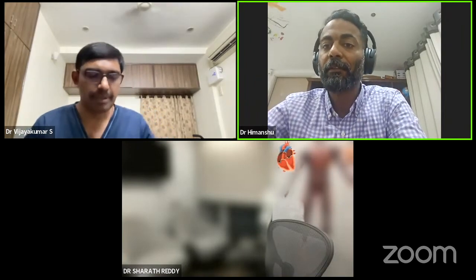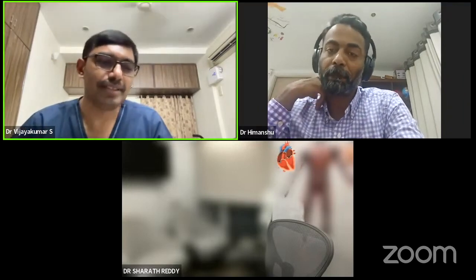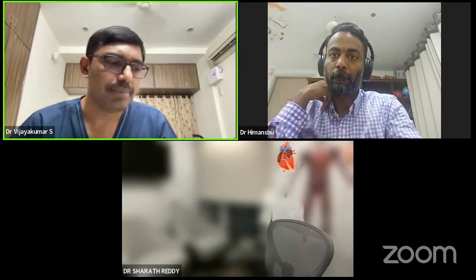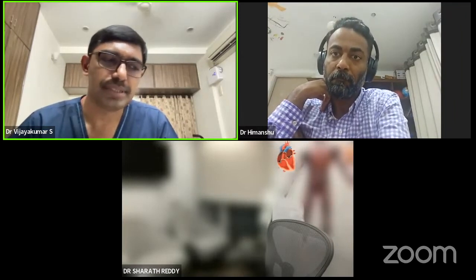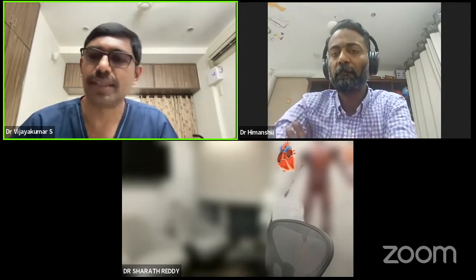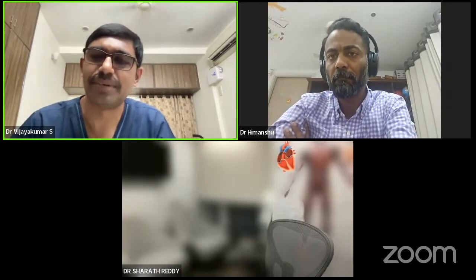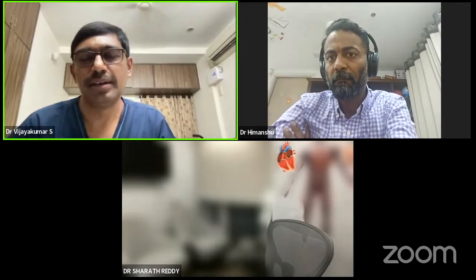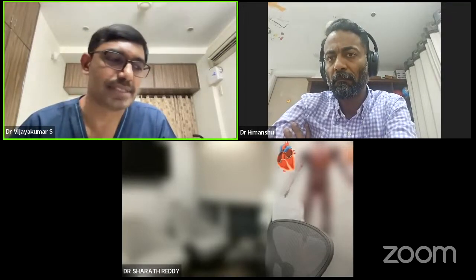Dr. Vijay, we should have your comments, please. Yeah, it's a valid comment, Dr. Himanshu. And maybe, what do you think about this distal LCX? Sharath has done POBA to that. I don't know, maybe the vessel was very small, or like a reasonable sized OM branch. What do you think about it? Maybe if it is stentable, first stent that.